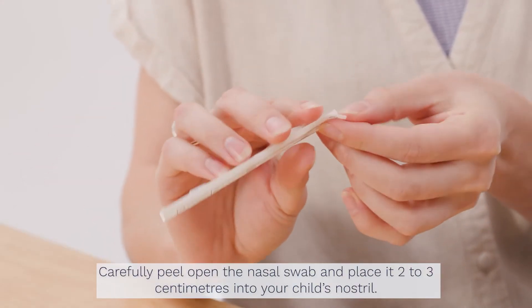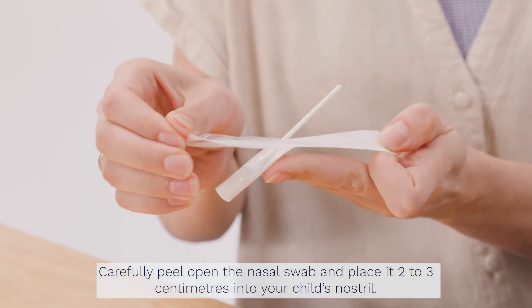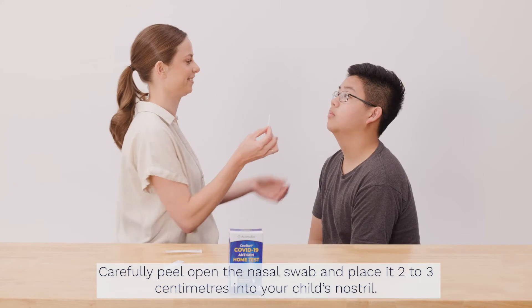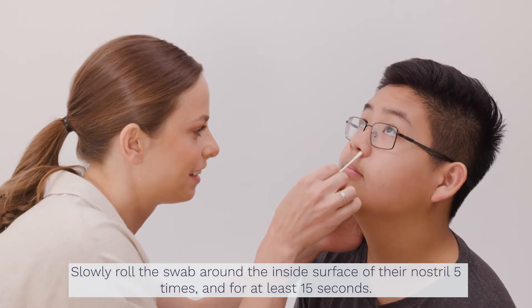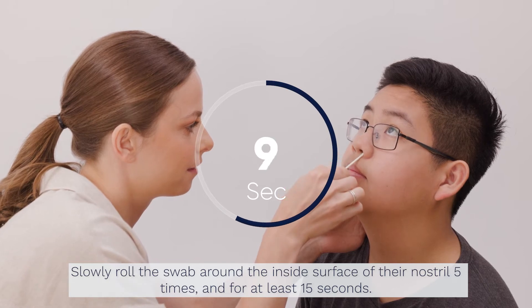Carefully peel open the nasal swab and place it 2 to 3 centimeters into your child's nostril. Slowly roll the swab around the inside surface of their nostril 5 times, for at least 15 seconds.